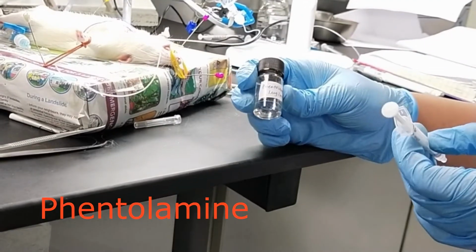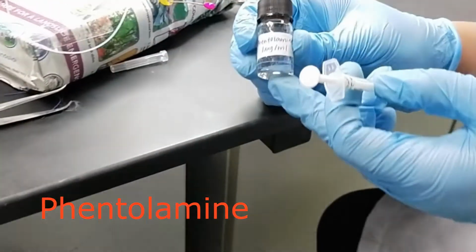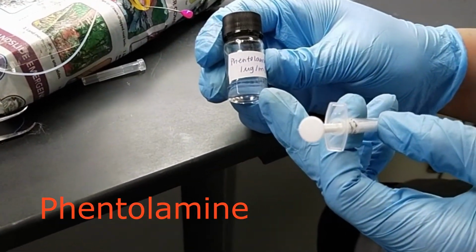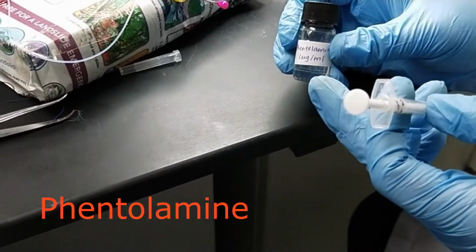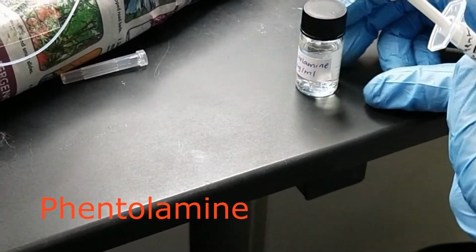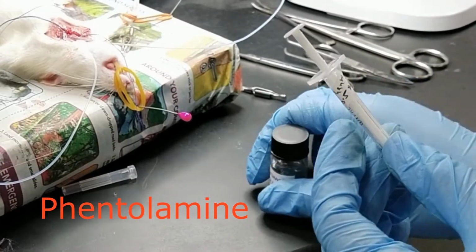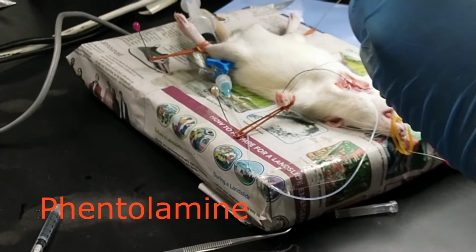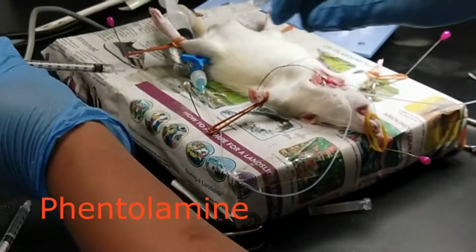So next we're going to proceed with the phentolamine, the pre-treatment with phentolamine. So the concentration for the phentolamine is 1 microgram per ml, and then the dosage that we need to use is 0.5 microgram per kg. Okay, so we're going to proceed by injecting 0.1 ml of phentolamine into the system.